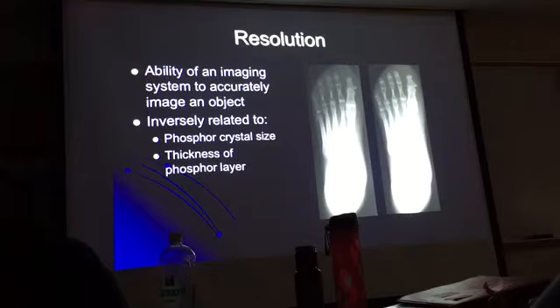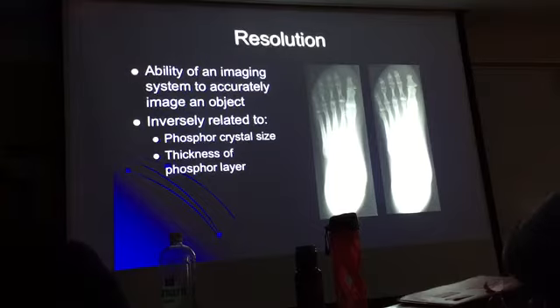John, what do you think? I think the one on the right looks less grainy. Okay, less grainy. And the other one has more density, so I'm thinking that must be a thicker layer of phosphor crystal. But these are the images, so it's not screen mode. Those are the images. There's more detail on the one on the left in the brighter areas.